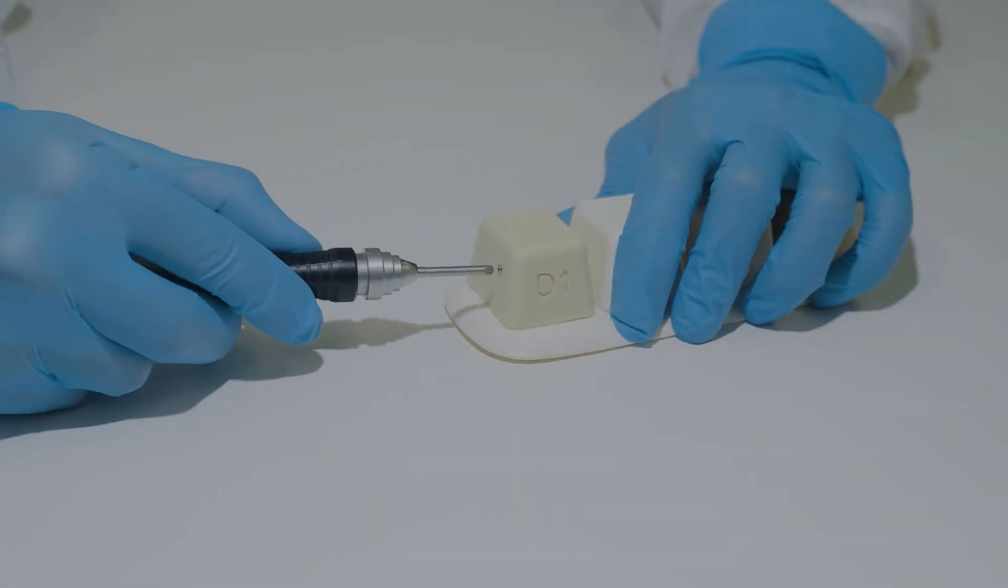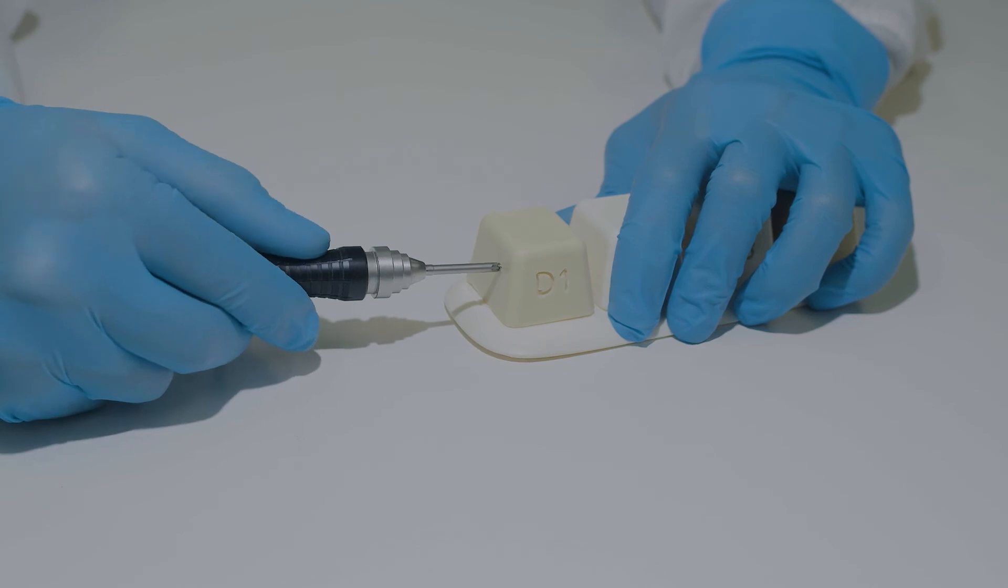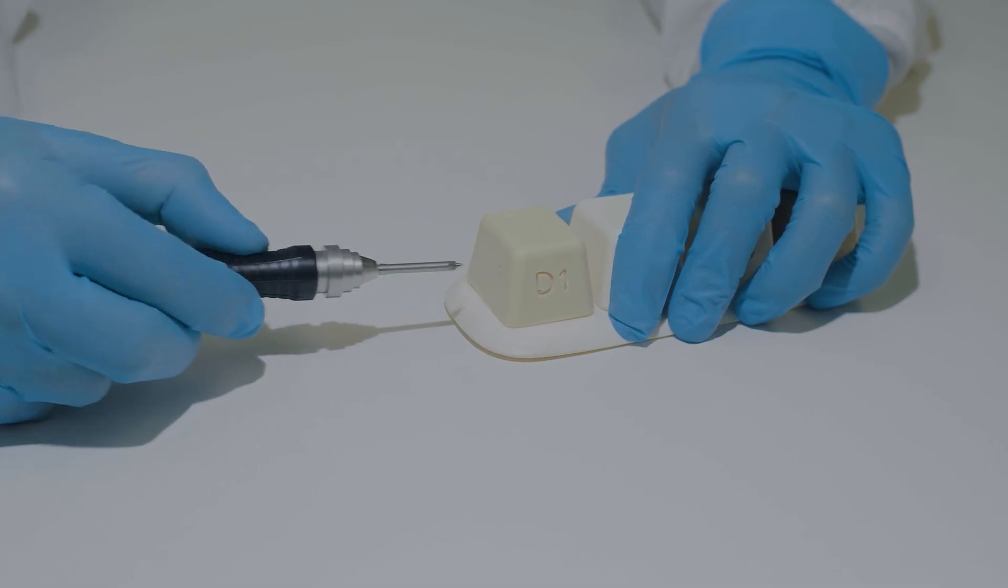When the screw is ready to be removed, it is the exact same process except turning the black piece counterclockwise.